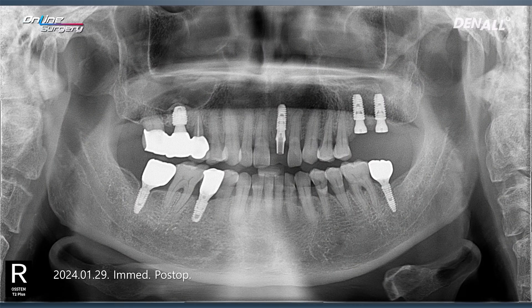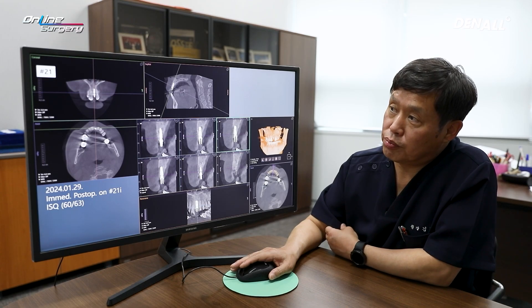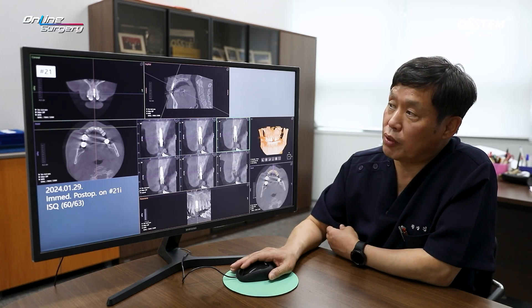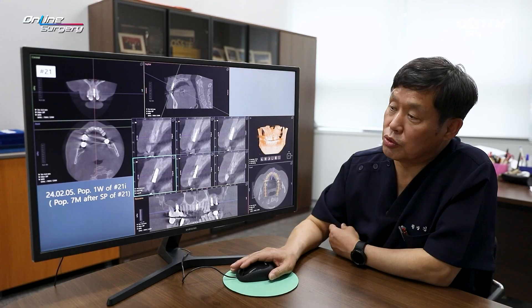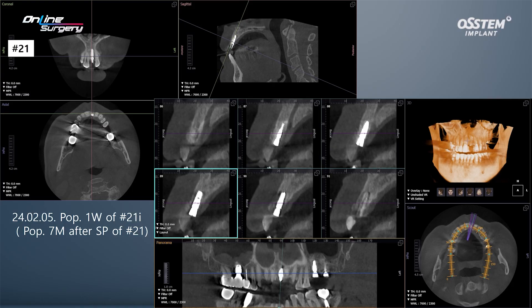Initially, we tried placing an abutment in the immediate post-operative procedure, but the initial stability was lower than expected. Thus, it seemed better to submerge the implant. We used a dual zone approach to determine the extent of the bone graft. This was re-evaluated using CBCT during surgery. At that time, the ISQ value was only around 60, making it difficult to proceed with a provisional restoration immediately. So, we opted to switch to a healing approach and replaced it with a healing abutment. Looking at the labial area of 21, we performed a graft using AOS collagen in a dual-zone approach to support both the bone and soft tissue.